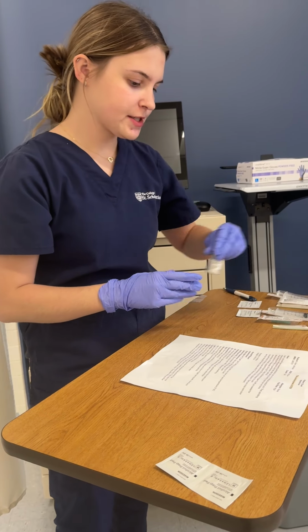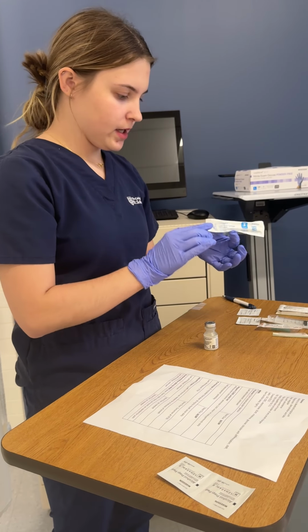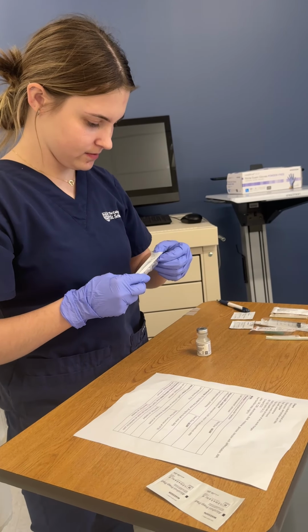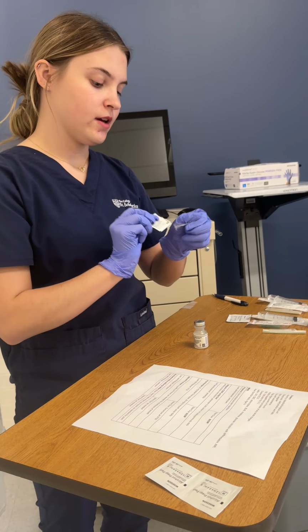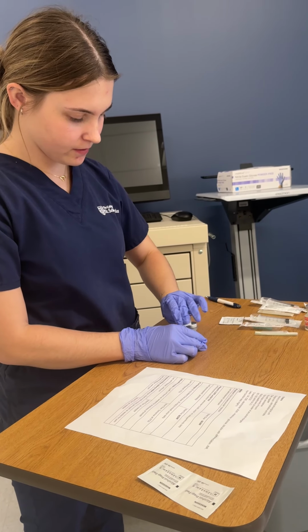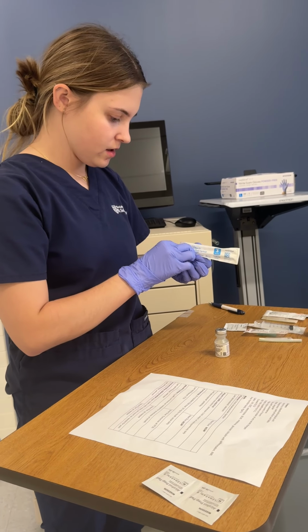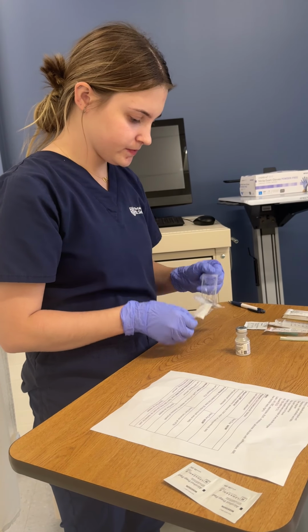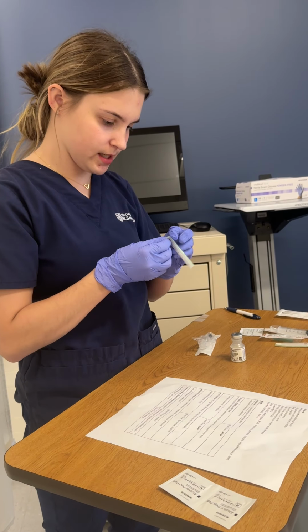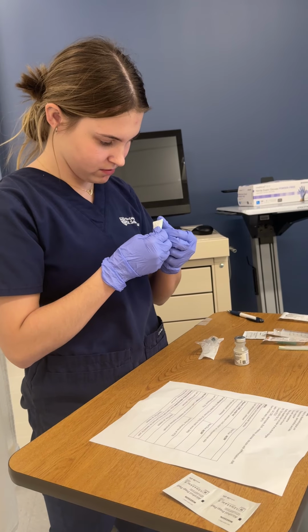Okay, so the first one we're going to draw up is the flu shot. So we are going to take our syringe. Well, first we're going to clean the top of this bottle for 15 seconds, and then we're gonna let it air dry for a second. Then we're gonna open our syringe and grab our blunt tipped needle to draw up the medication.